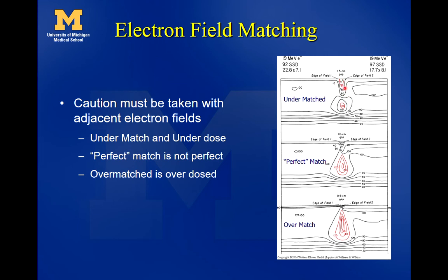These are the 30, 60, and 90% isodose lines. They're saying that these two beams are 1.5 centimeters gapped. So if you were to look at the light field of these two beams, they'd be about 1.5 centimeters apart.